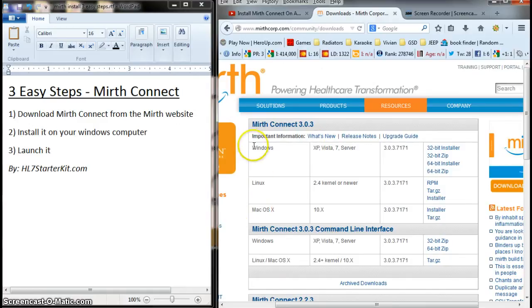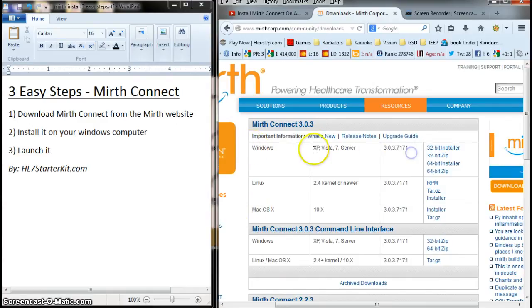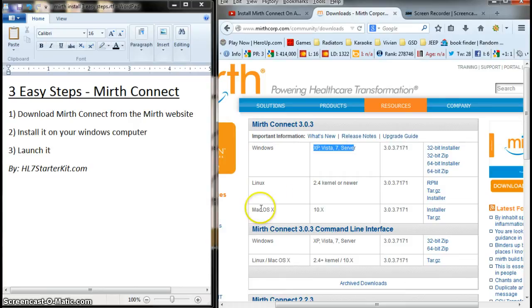And here are the versions of Mirth Connect. We're going to do the Windows for XP, Vista, 7, or Server. Pretty much any Windows operating system out there.